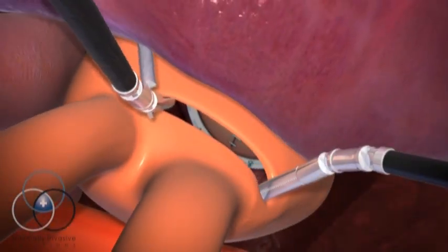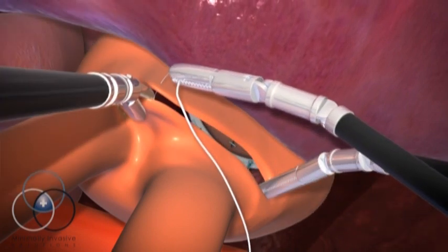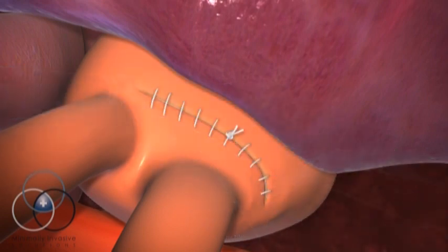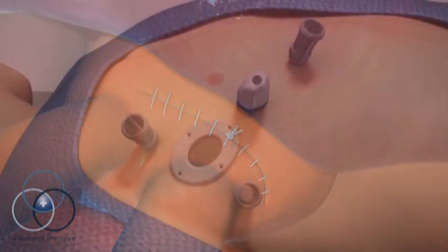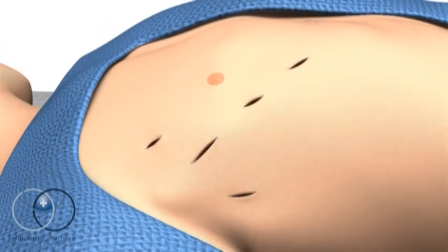Once the repair has been tested, the atrium is closed and the heart is restarted. The surgeon undocks the robot, takes the patient off the bypass machine, and then closes the incisions.